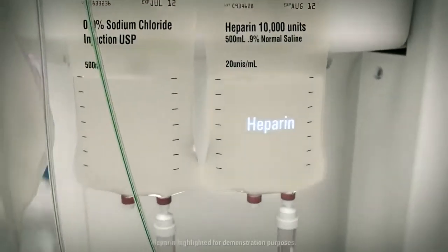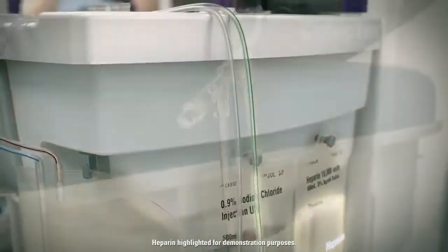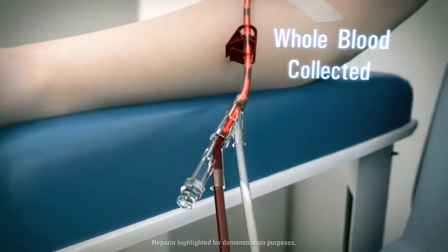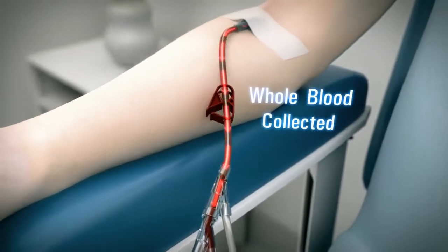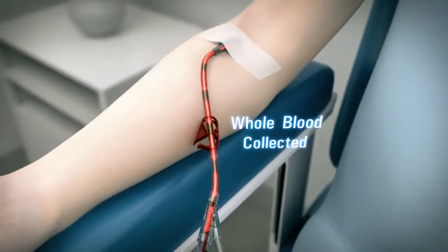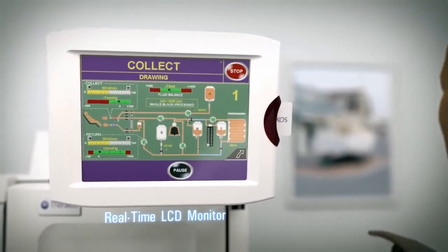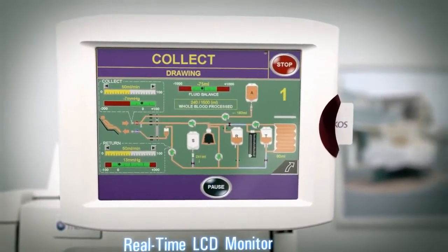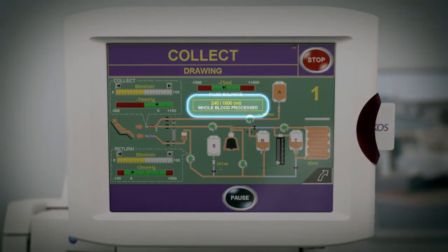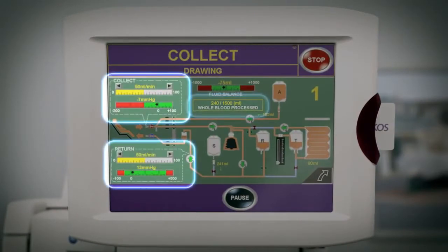While simultaneously being treated with heparin to prevent clotting, whole blood is removed from the patient and sent to the Theracose Celex photophoresis system. Throughout the procedure, the real-time color LCD monitor displays informative graphical and textual readings including processed blood volume, collect and return rates with corresponding line pressures, and fluid balance limits.